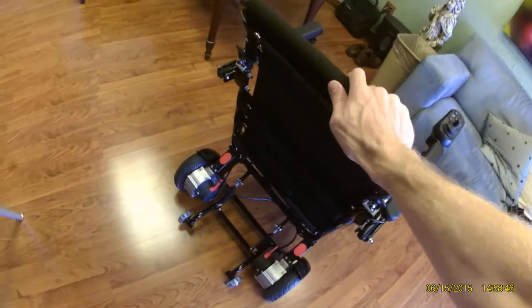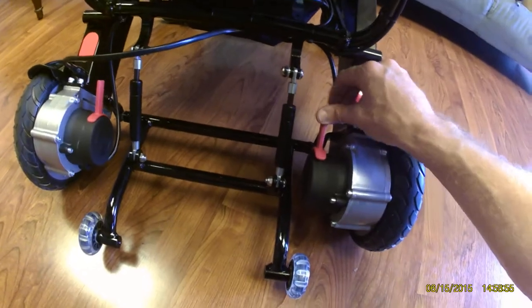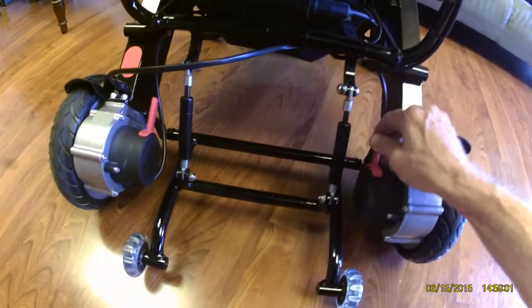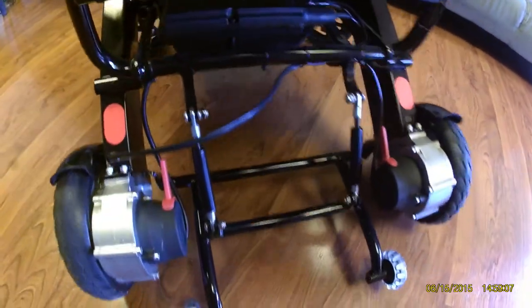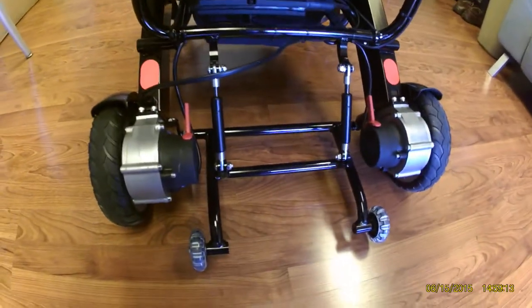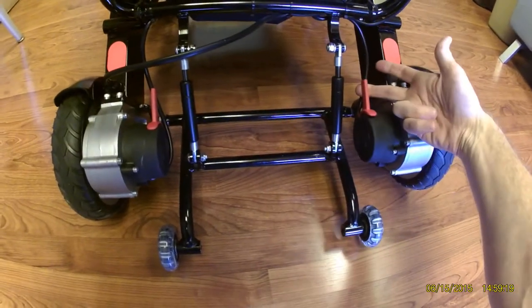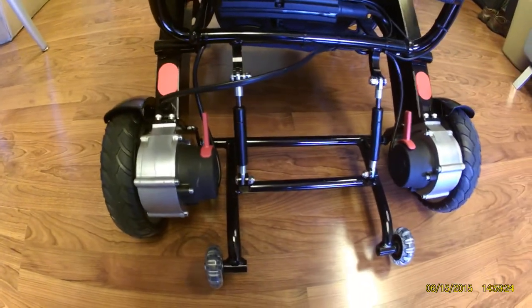Once the joystick is on, I want to make certain that everybody understands that the wheels on the chair are locked. These red buttons right here will make this a neutral chair simply by sliding them forward. The chair is then in manual mode, and if you turn the joystick on while the chair is in manual mode, it is not going to operate — it is not going to go anywhere. You would want to make certain that those levers are back so that the motor is engaged.